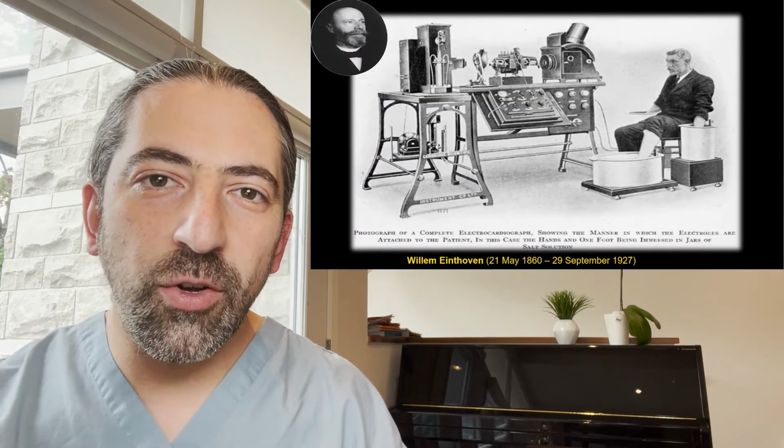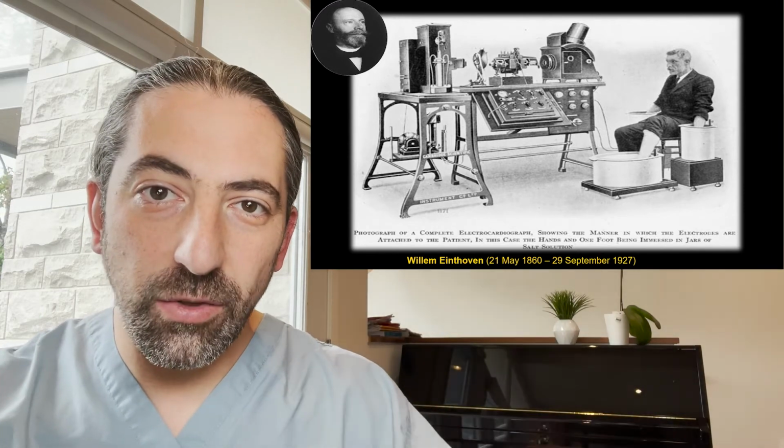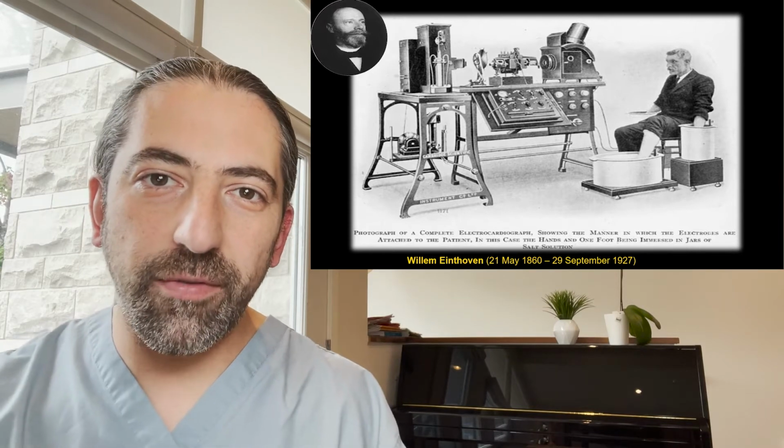So the ECG, or electrocardiogram, is a cardiac diagnostic tool that is used to assess electrical conduction within the heart. It was first invented many years ago by Dr. Willem Einthoven, who found out that by soaking his limbs in salt solution, he could record the electrical activity of the heart and display it in graphical format.